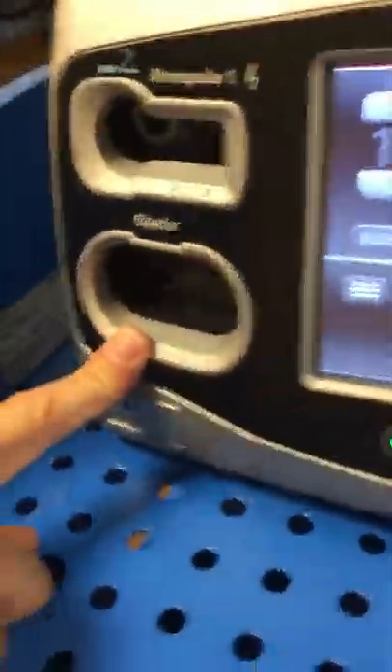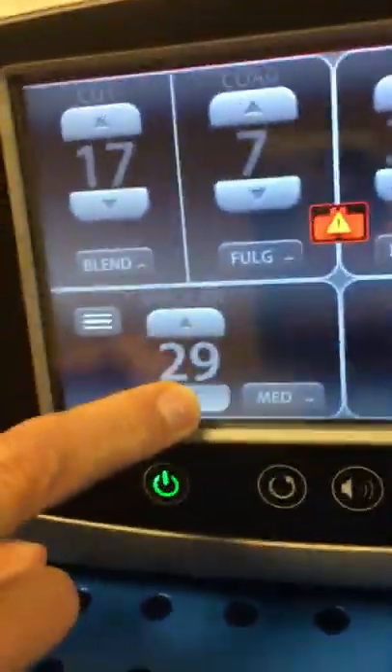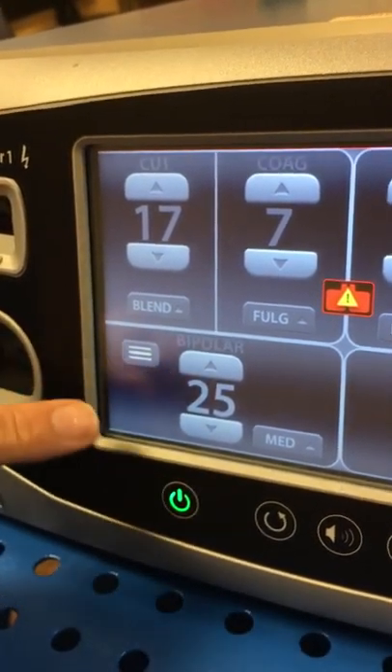Down here in the third quadrant we've got bipolar. You can again set your bipolar setting with the touchscreen. You've got low, medium, and high.